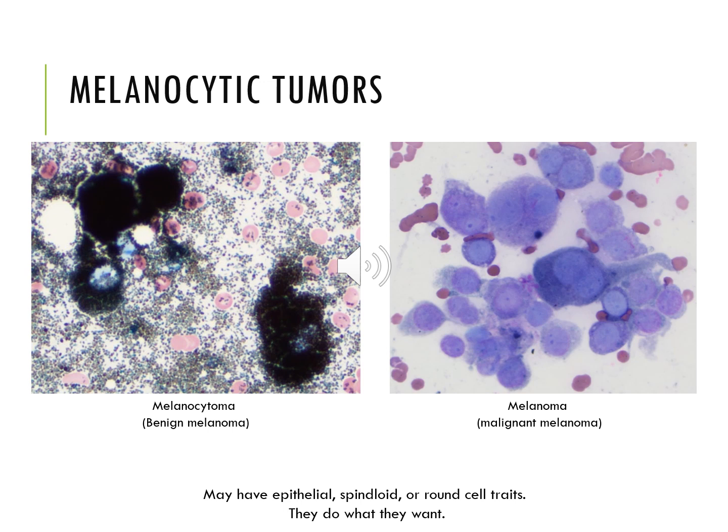You have to go to higher mag to see them. And then you also have much higher criteria of malignancy here as well. Usually the poorly granulated melanocytic tumors are much more aggressive. The placement affects the malignancy as well, so where they're found on the body.